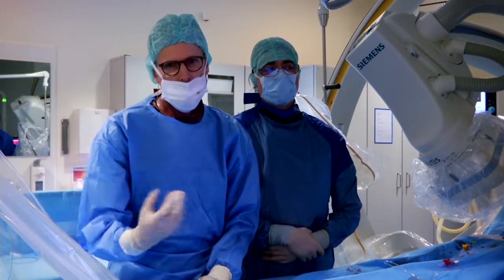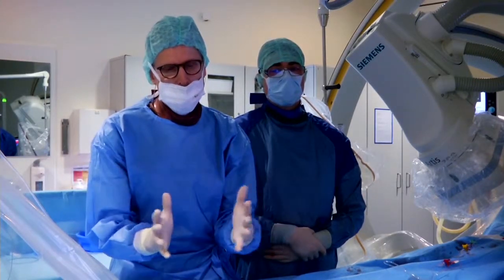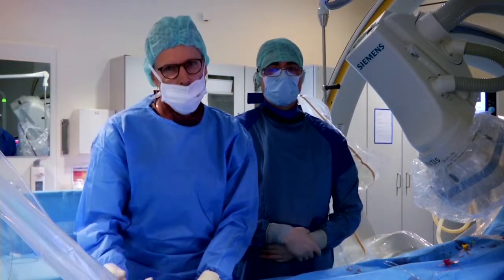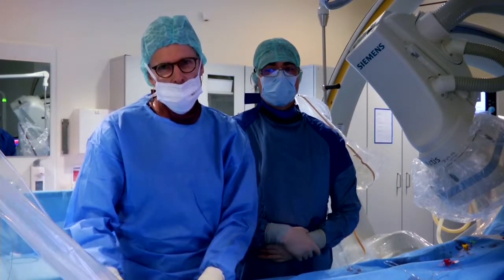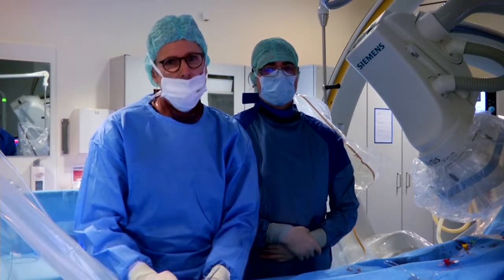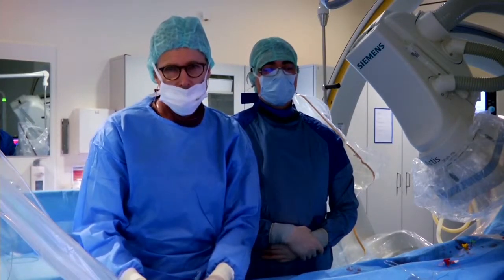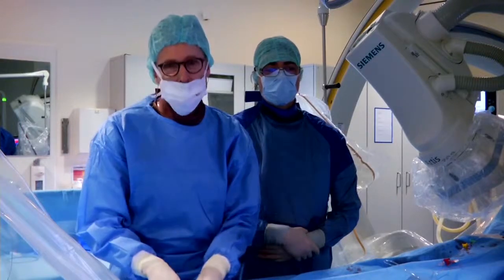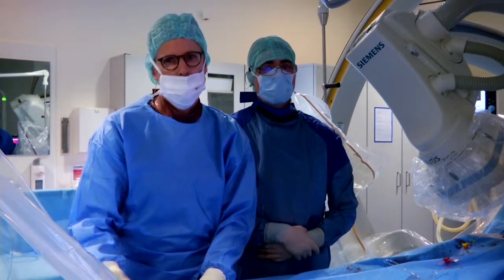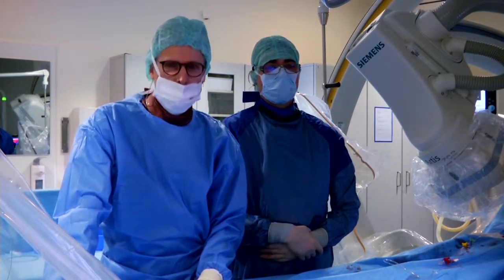When you first try to break it, it can happen that by the foreshortening, this is a little bit more difficult. You need more pressure, and more pressure means more risk for dissection or any other kind. So we definitely would go first for a stent, perhaps in this case a covered stent to cover the edges with this dissection, and then give full power with the ultra-high pressure balloon. Very good, important information. Thanks, Peter. Excellent, thank you.